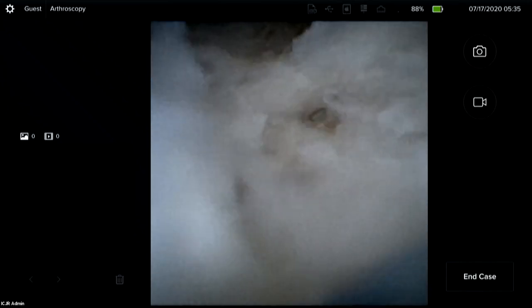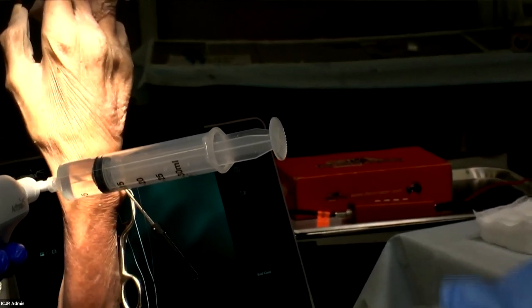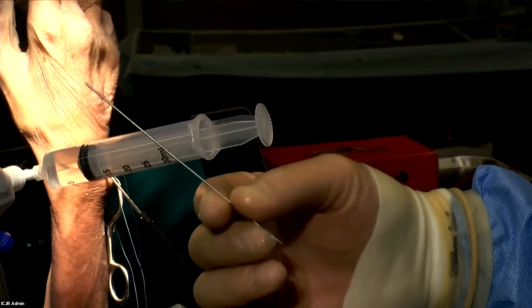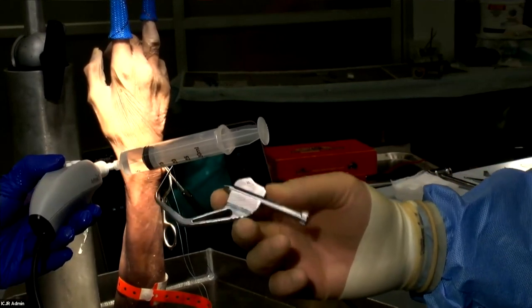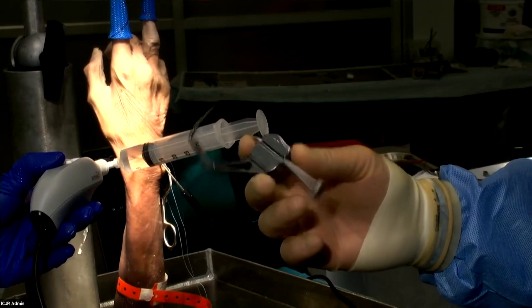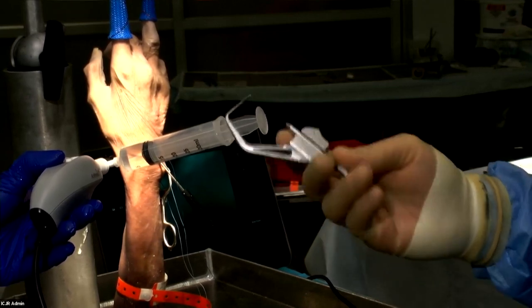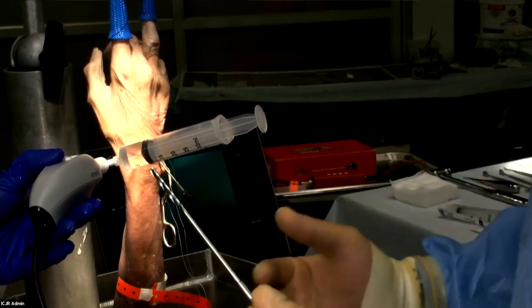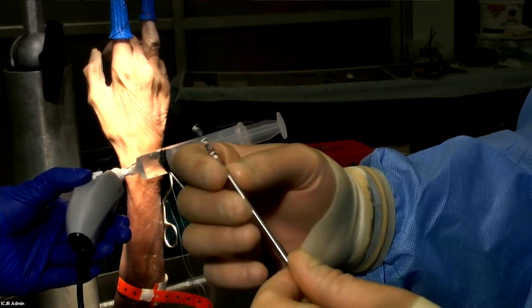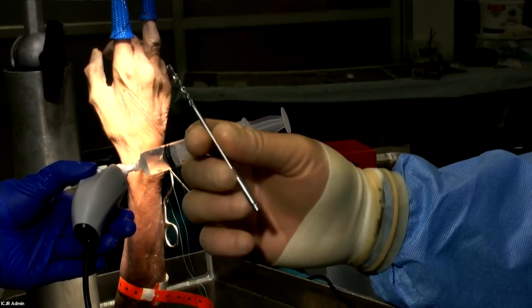The steps of the ulnar tunnel procedure: first, a K-wire goes up through the ulna into the fovea. There is an arthroscopic guide you can use, though normally I'd use fluoroscopy. Then, over the K-wire, this reamer goes from the subcutaneous border of the ulna up into the fovea where you've placed your guide wire. This creates a 3-millimeter tunnel from the subcutaneous border of the ulna up into the fovea.